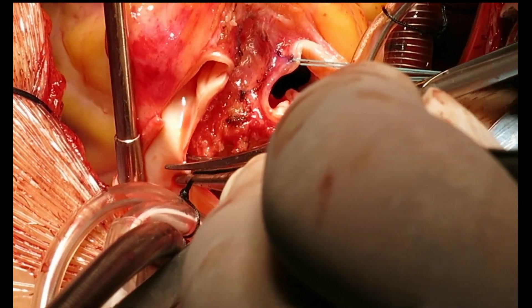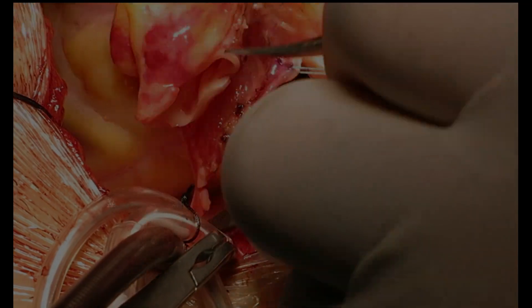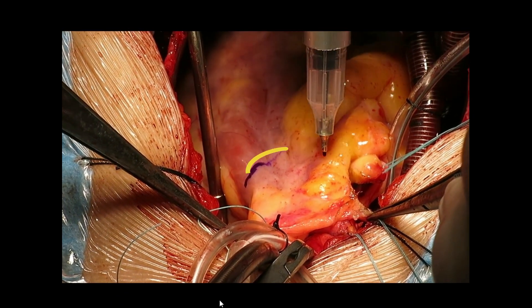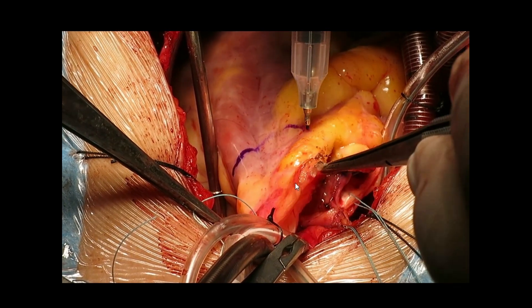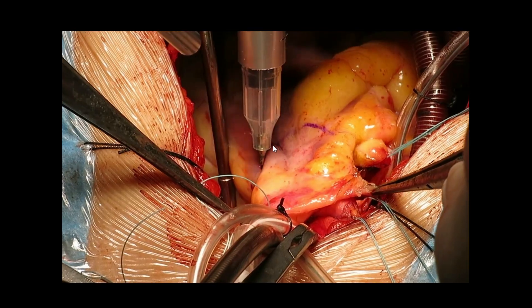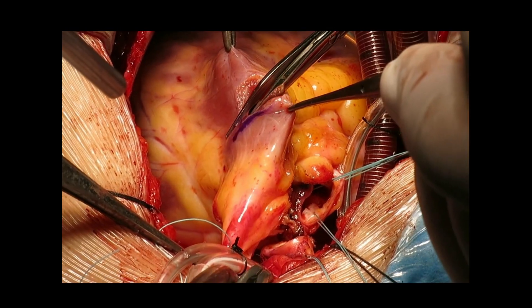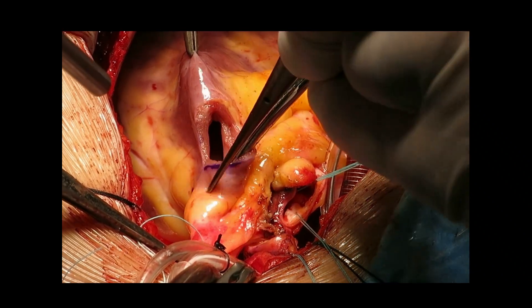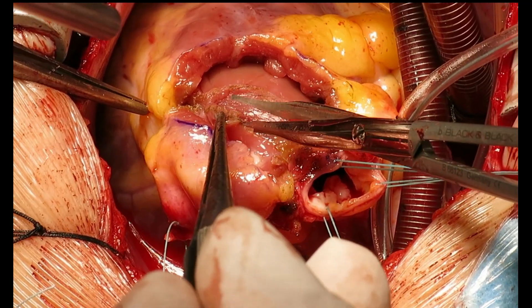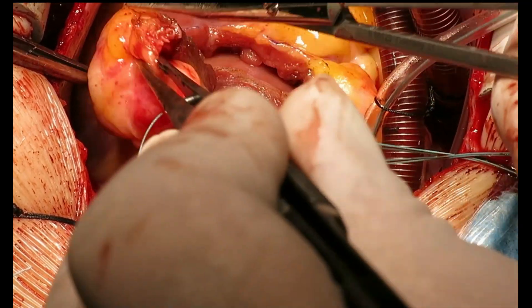The pulmonary artery is then transected for autograft harvest. Given the anticipated need for annular enlargement, we make our RV incision more apically to preserve a portion of muscular RV free wall attached to the autograft annulus. The incision then extends into the septum for complete autograft removal, being careful not to damage the septal branch.